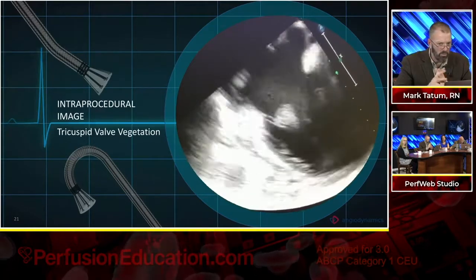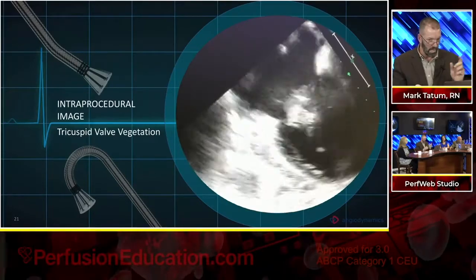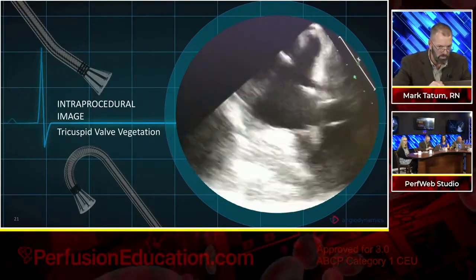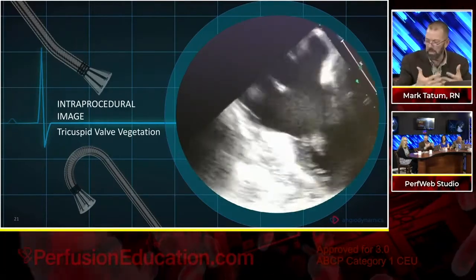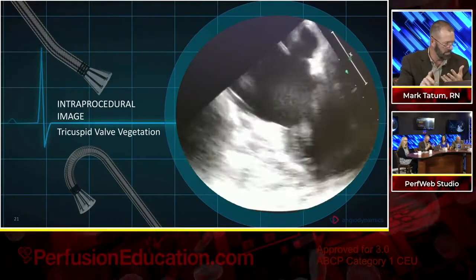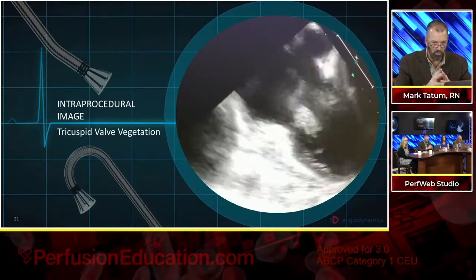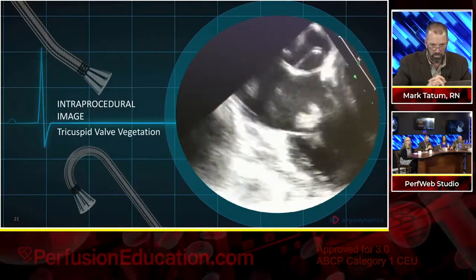Now you saw the vegetation that was sitting on the table there. The vegetation measured up to 5 centimeters, I think, 4.5 centimeters. On this image, would you have guessed that you have 4.5 centimeters of material? No. This illustrates the point that I was bringing up earlier, which is skill of the practitioner, rotating the probe, making sure that they're able to see as much as possible, makes a huge difference in evaluating what it is that we see. All right, let's go to our next slides, please.